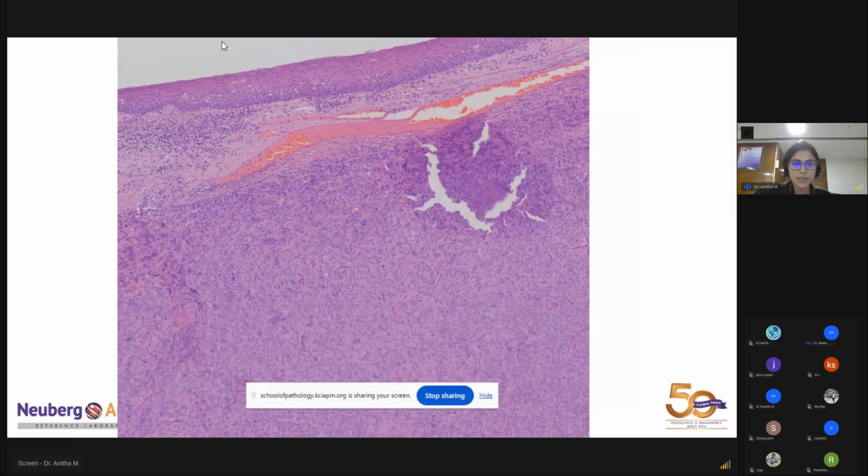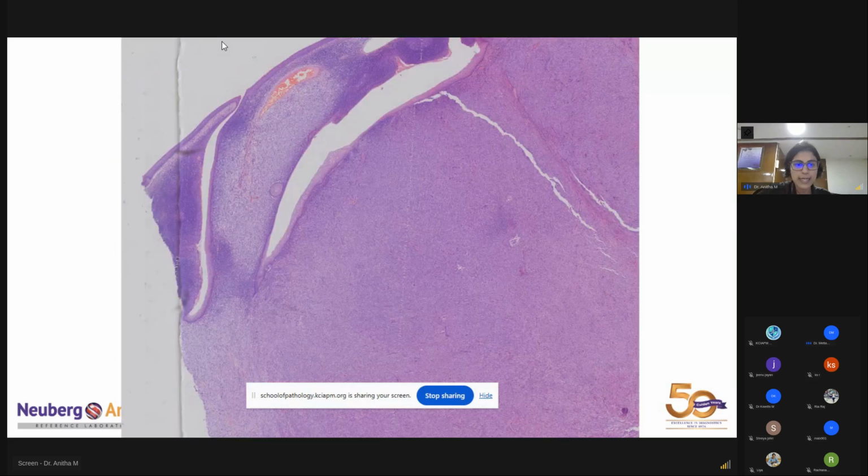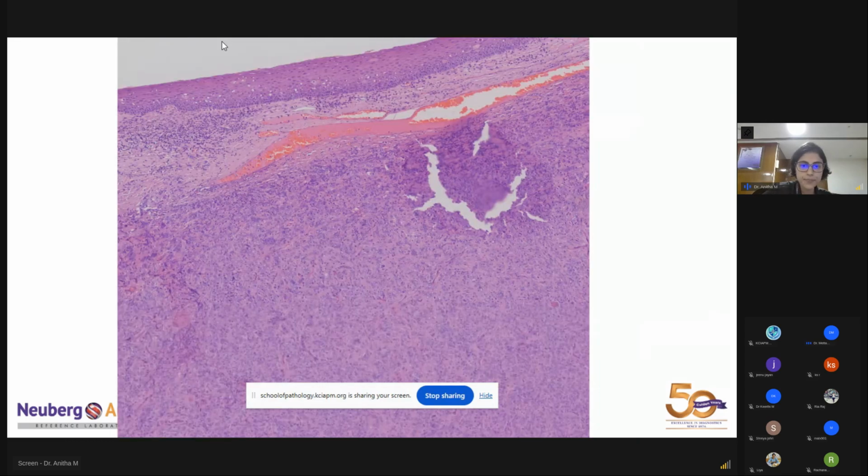So it's not a squamous cell carcinoma, but I feel that from a practical standpoint, maybe it's better to exclude it. As you said, there was tumor. It had a very pushing margin, which is also another thing which is not in favor of an SCC, because you would expect to see infiltrative margins, a lot of necrosis and mitosis if it was an SCC, none of which was here, and more of pushing margins as you can see in this slide.